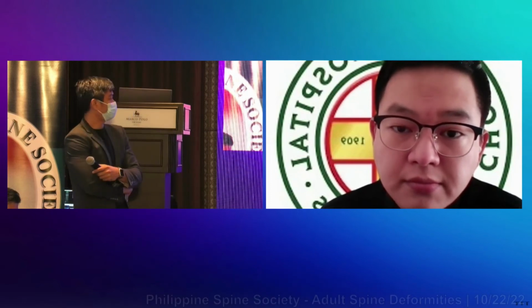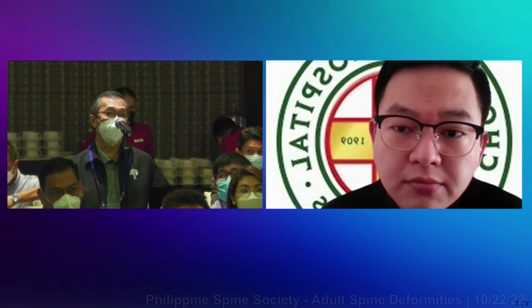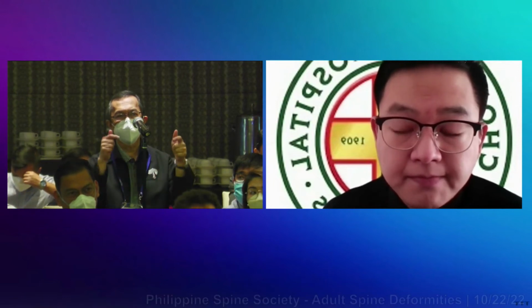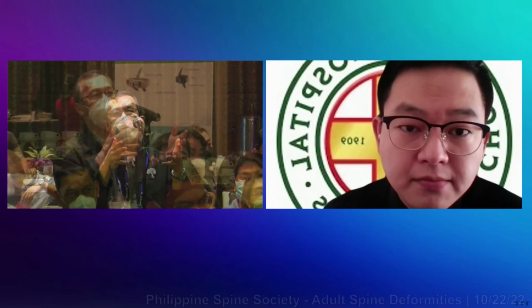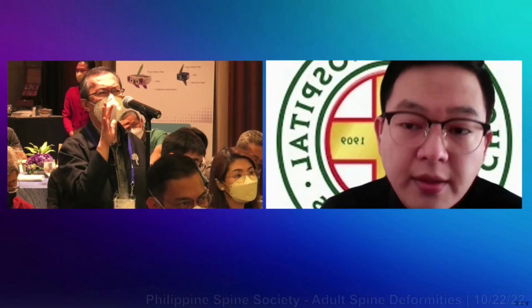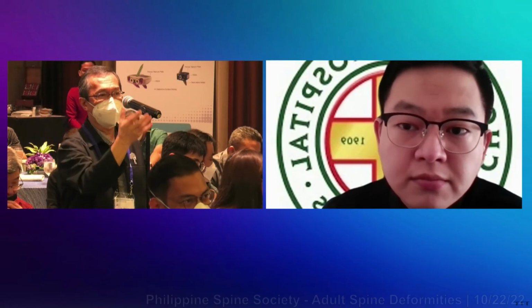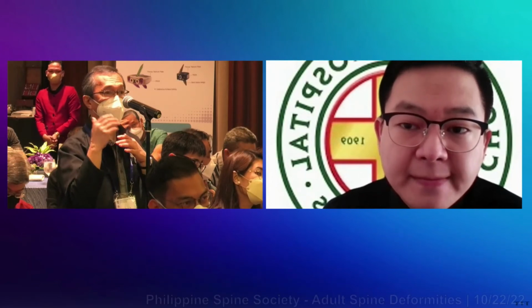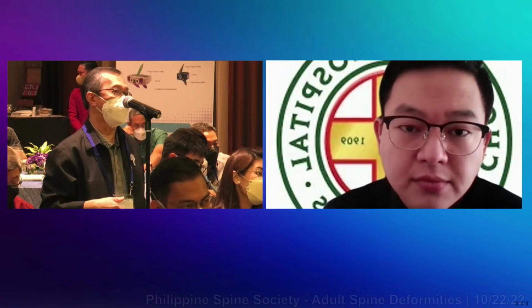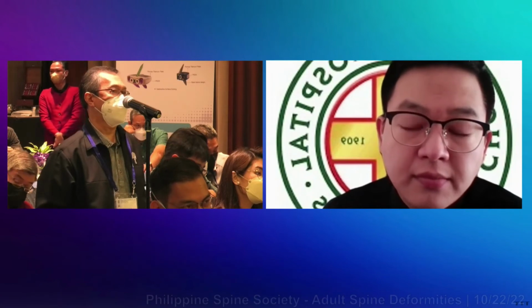Thank you. That's a nice case. But we were just discussing with my seatmate here. This is an intradural long tumor, isn't it? Why were you not able to do instrumentation in that laminectomized portion? Was it because you sacrificed the pedicles or facets, and therefore you cannot put fixation at that level? That's a problem. As mentioned, you have a long skip area that was not instrumented, and it's a very long construct, so the rate of failure will be very high. So what was the reason why it was not instrumented?